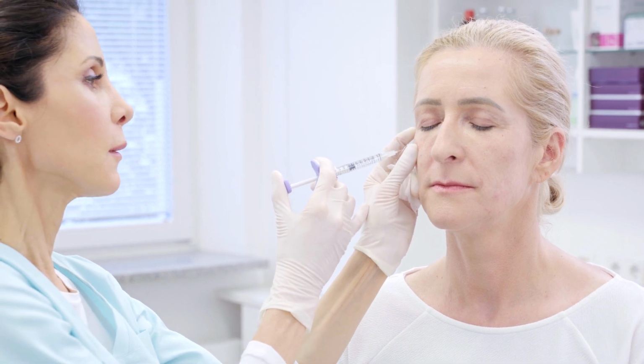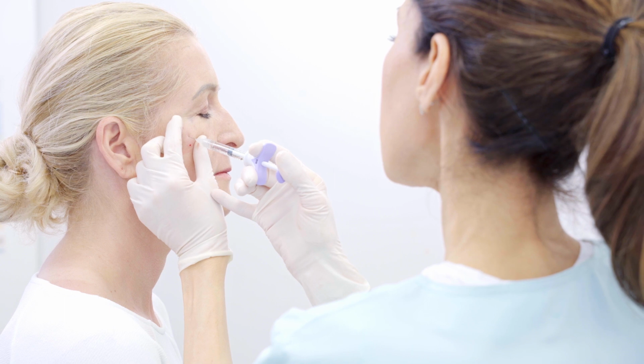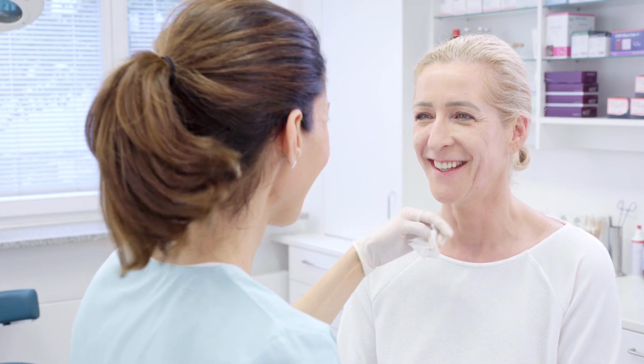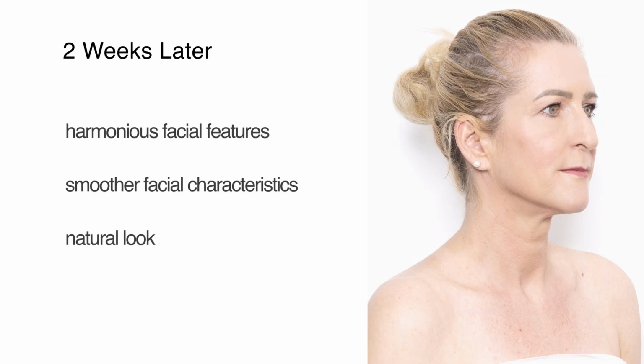As you may have noticed, the patient has been completely calm and relaxed throughout. The effect of Botox will not be fully developed for a few days, and the already visible effect of the hyaluronic acid will continue to improve. Hence, it will be about 2 weeks' time until we may judge the final results. Well, we are done now.